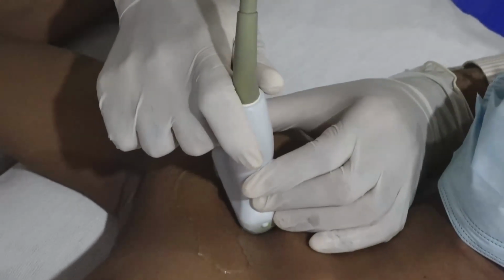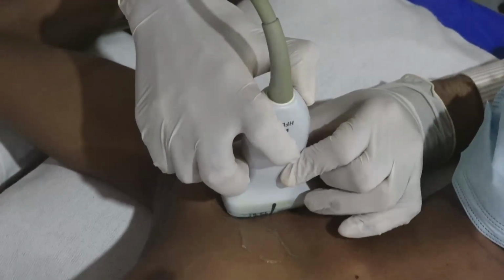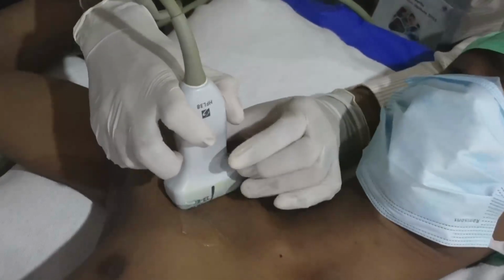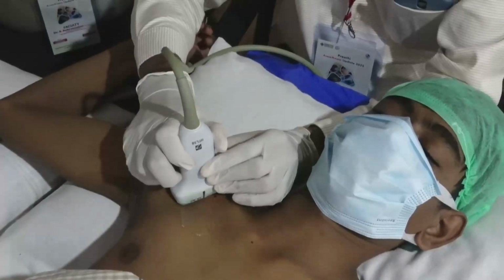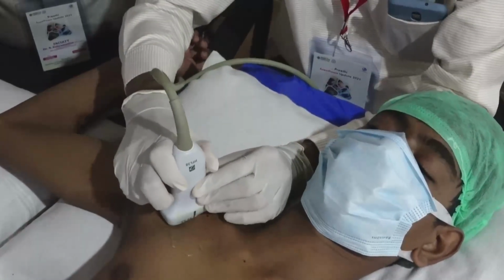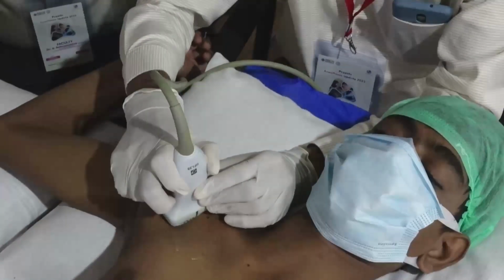Again, rotating the probe. Sometimes it is difficult to identify the cords in the infraclavicular area. Either we can move laterally, and medially we can differentiate. If you move laterally, the cords are well differentiated.